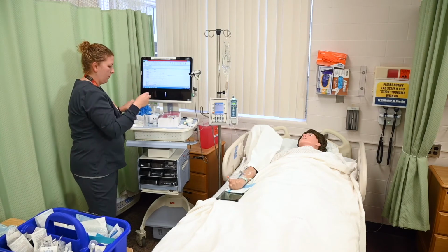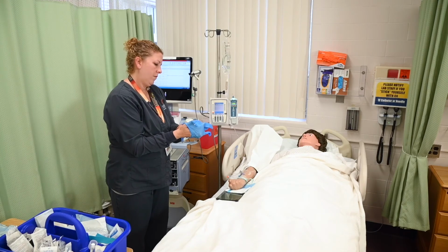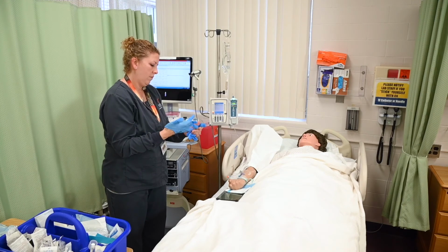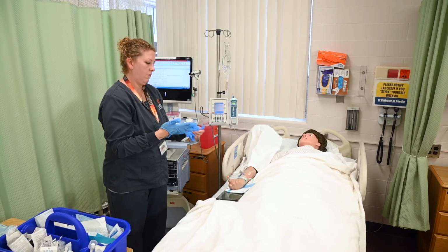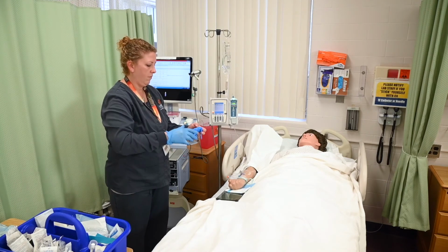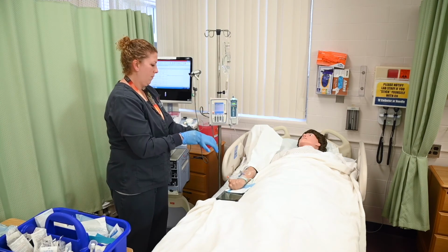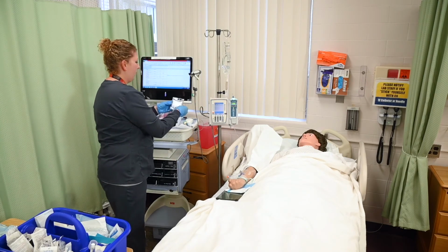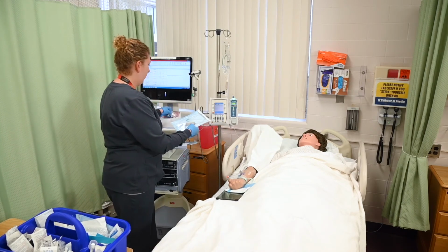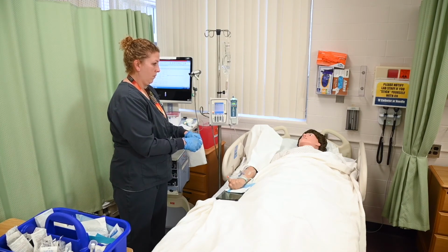I'm going to be moving on to the IV Piggyback at this time. Going to prepare her secondary tubing, so close the clamp on the secondary tubing and connect tubing to the IV Piggyback medication without contamination.